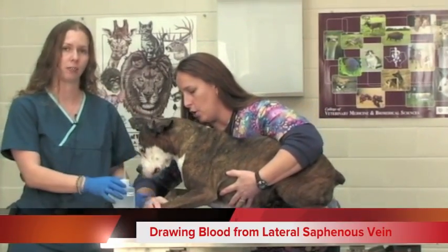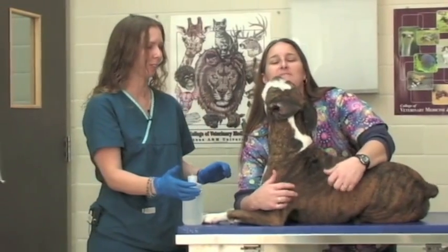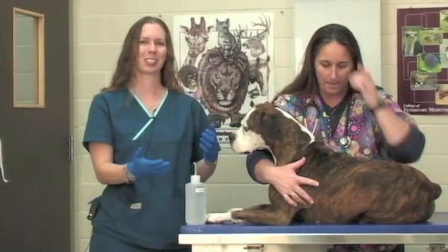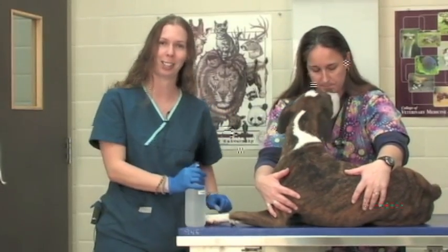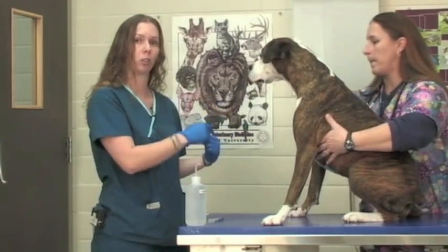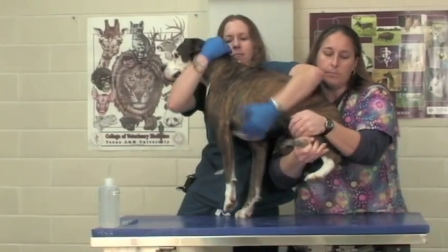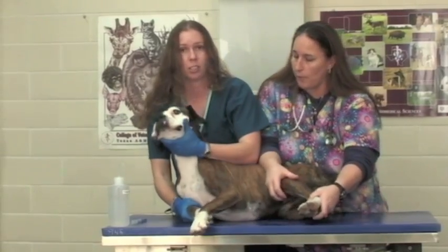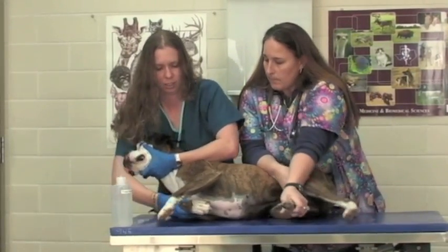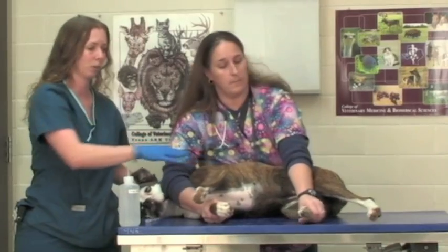In order to draw blood from a lateral saphenous vessel, which is in the back leg of your patient, your patient needs to lie down on one side or the other. Sometimes the biggest trick is to actually convince your patient to lie in either right or left lateral recumbency. We are going to have Winn-Dixie lie in right lateral recumbency — with larger dogs this could take more than one person. When a patient is in lateral recumbency you always want to place your hands on the down leg to help control your patient as they lie on the table.